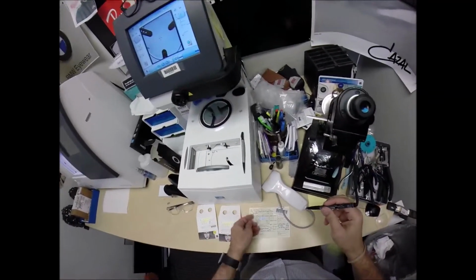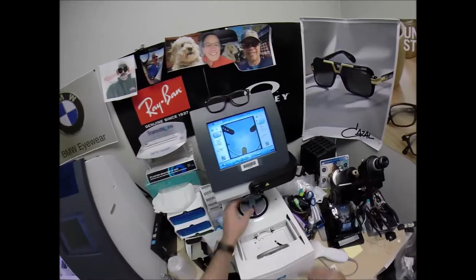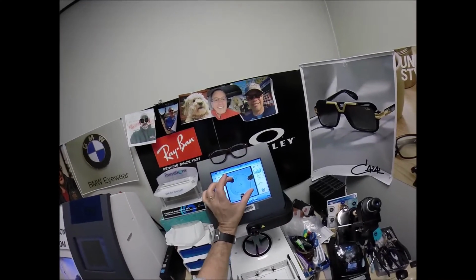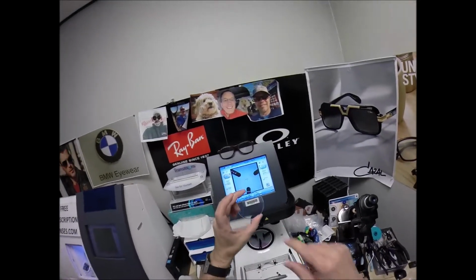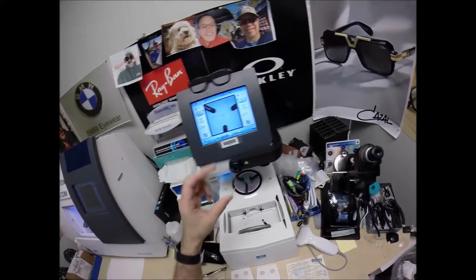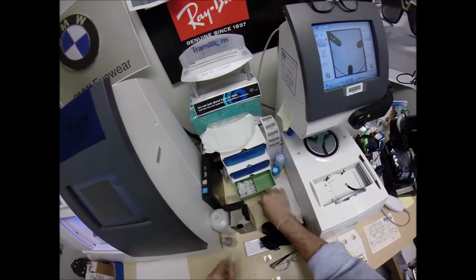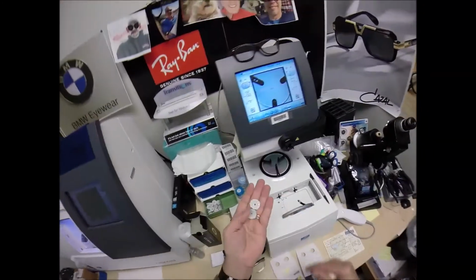And again, that's the left lens. If y'all need me to recap any of this, I'm going to do it again. So, alright, the reason why I put those 3 dots on there, it tells me that it's oriented in there just perfectly. I have 2 R's on here because it's from the Department of the Redundancy Department. Yeah, I know. Okay, so I need to get 2 blocks, which I will attach to your lens.